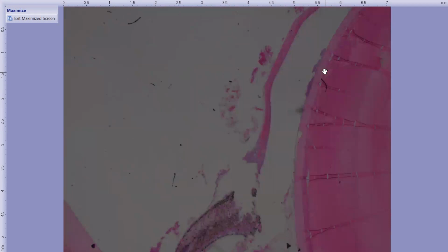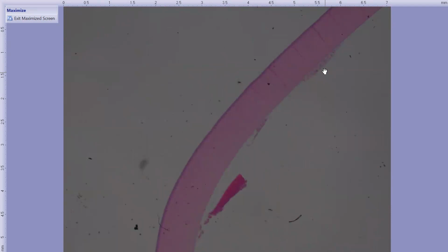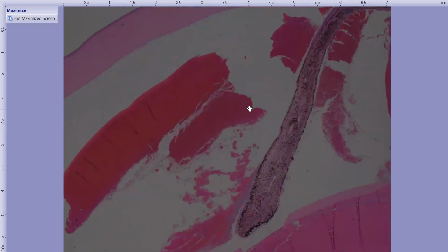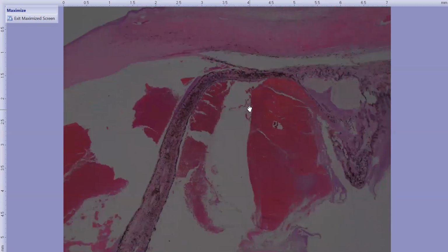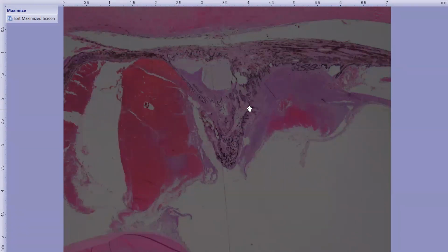Maybe between cases. So the front of the eye, the cornea is relatively normal. Here we are in the cornea. Here is the blood in the anterior chamber that we discussed. There's an iris leaflet. And then moving backward, oh, I should have done subgross. Oh, well, I'm going to go with it. All right. So here we are on the ciliary body. Here's the ciliary body. Here's the plica. So we have a very densely cellular population on the surface of the ciliary body.